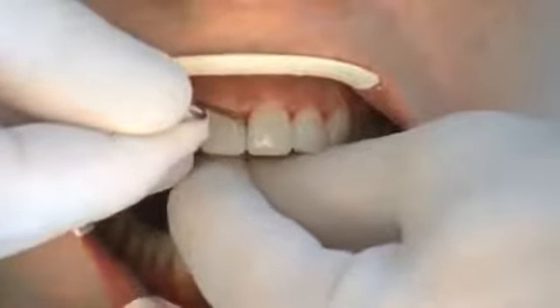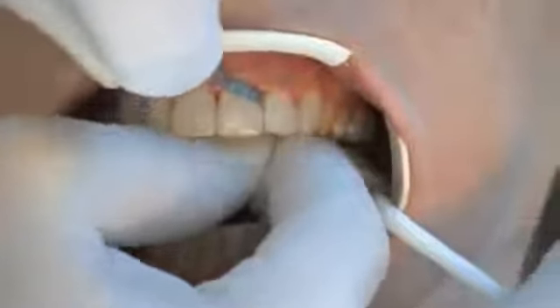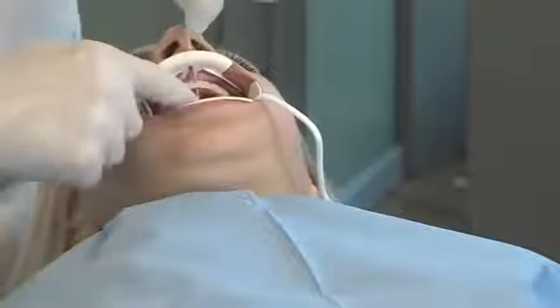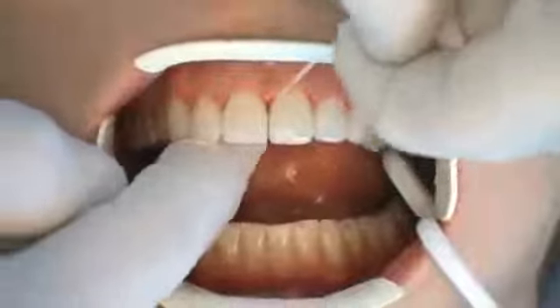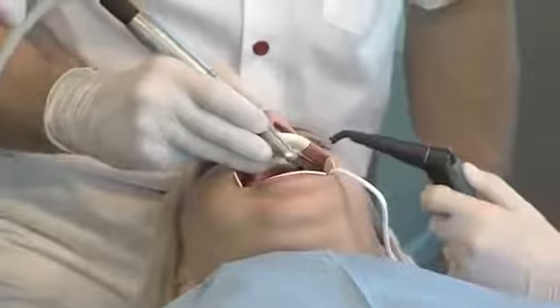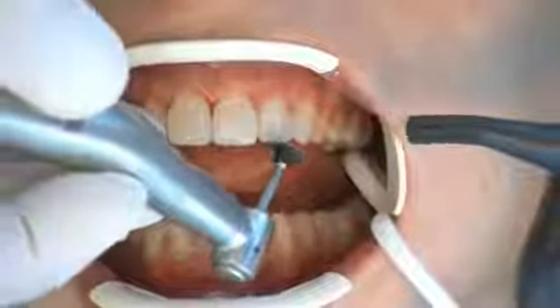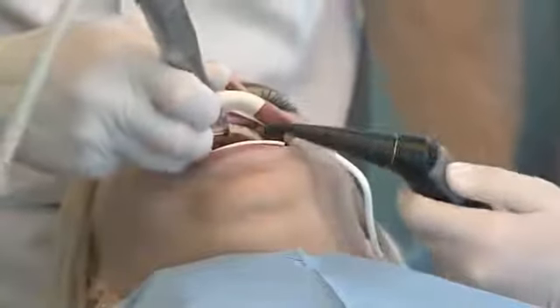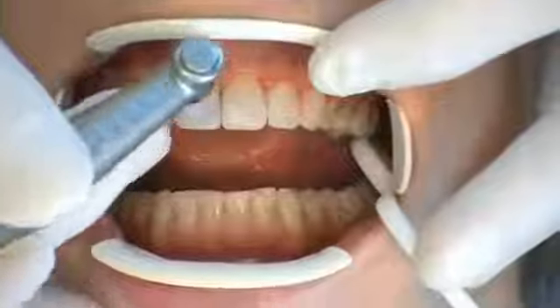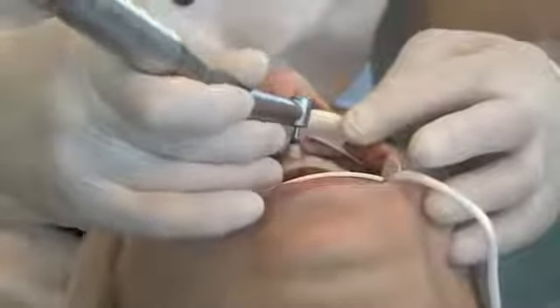Interdental contouring is carried out using diamond-coated strips, followed by polishing with ever-finer foil strips. Dental floss is used to ensure successful interdental polishing. Lengths and contours are corrected with slow-rpm coarse discs after polishing the marginal areas. Thin discs are suitable for the inter-incisal angle. The marginal ridges are contoured by bell-shaped pre-polishers and high-gloss polishers with air cooling.